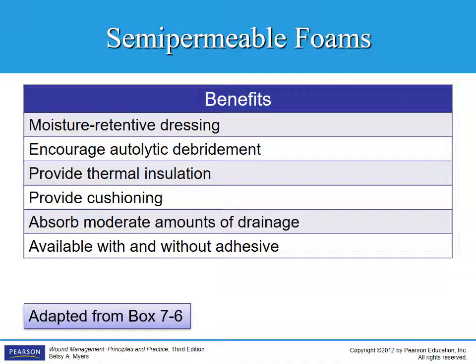Benefits is moisture retentive, encourages autolytic debridement, provides thermal insulation, provides cushioning. It absorbs a moderate amount of drainage, and it's available with and without an adhesive backing.